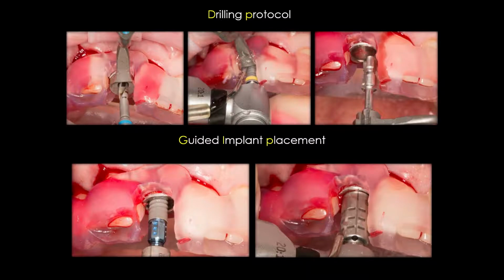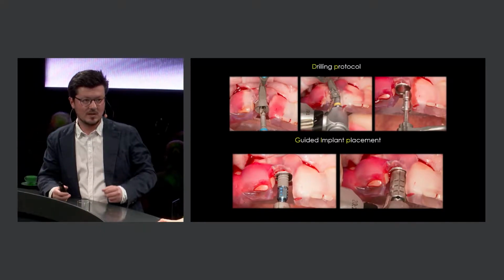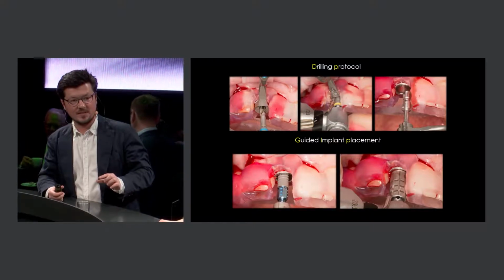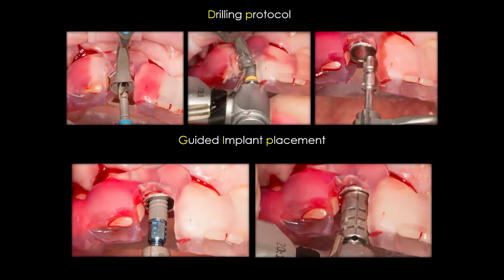There are two possibilities. Either we place the guided implant, or we can place a normal implant, any implant, even tissue level. Important that it has the relatively new Loxim adapter, and we can put on the so-called guided adapter. You can see that it has these markers, horizontal and vertical. The horizontal should correspond with the sleeve, and the vertical ones correspond with the lines that we designed, so we have the proper position.